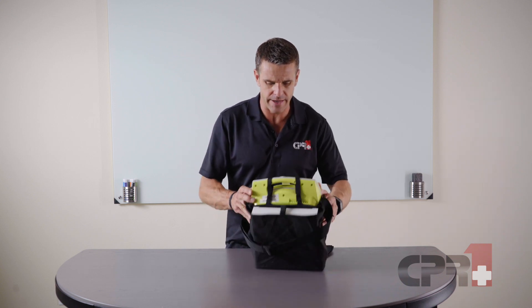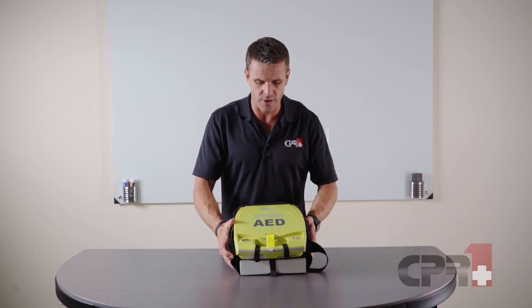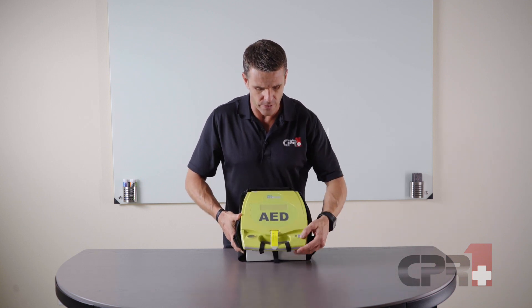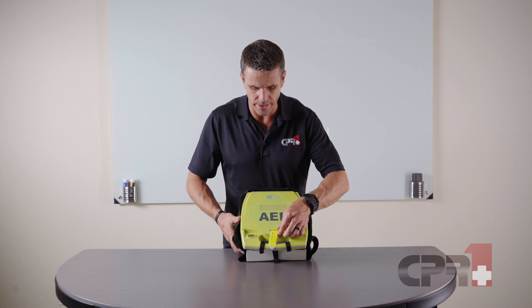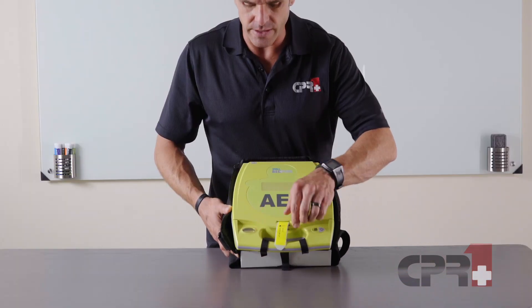There's a compartment on the back for any spare pads or pediatric pads. When we pop the unit open and turn it on, we can see the readiness indicator showing us that we're in a good status.